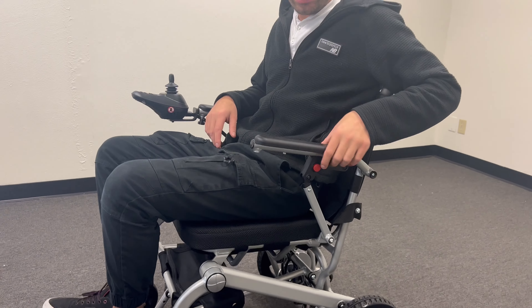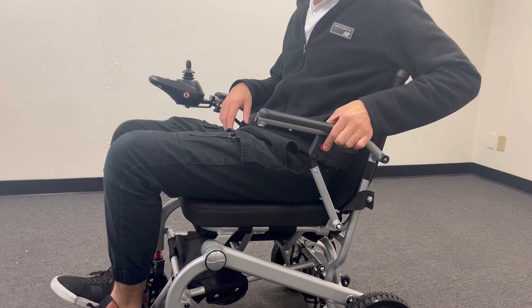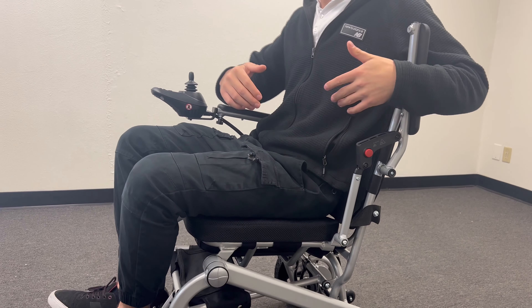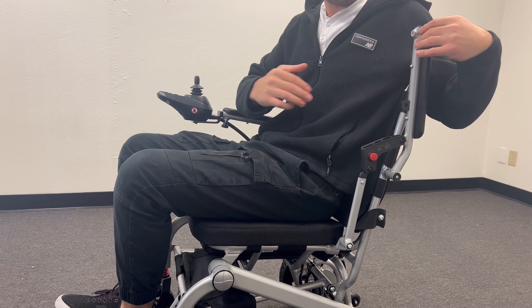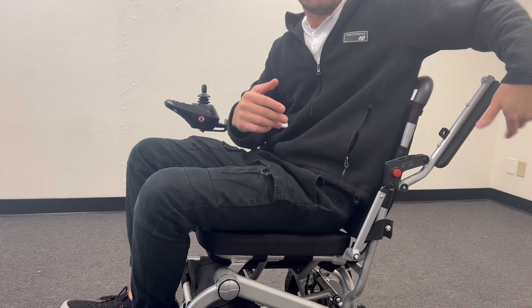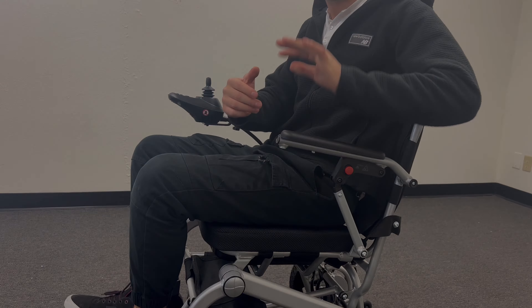There are a few things — we have armrests that are removable. Like here, there's a red button. You just press it and then you can open the armrest if you want, when you are trying to stand up. If you don't want to feel stuck, you can just put it back and move easily. Right here — put it back.